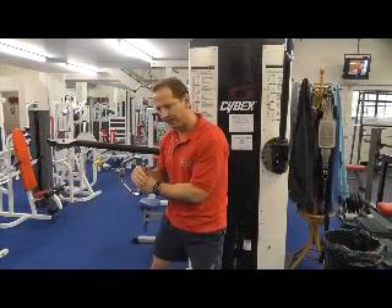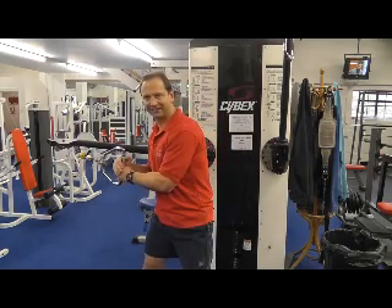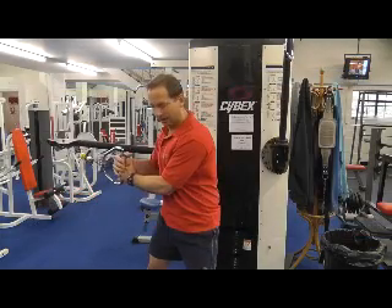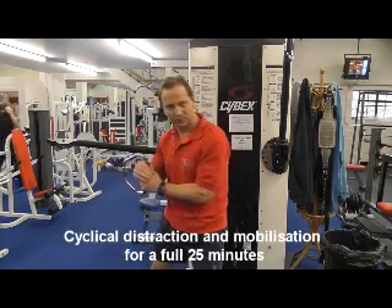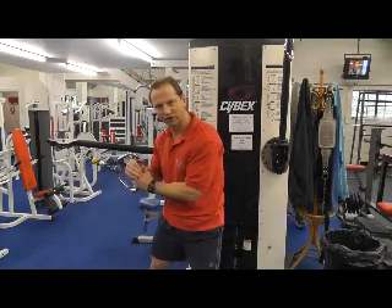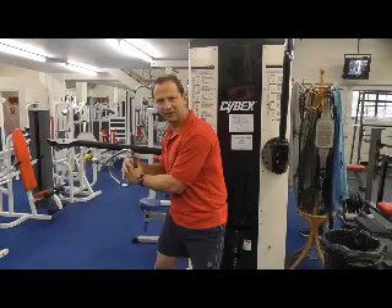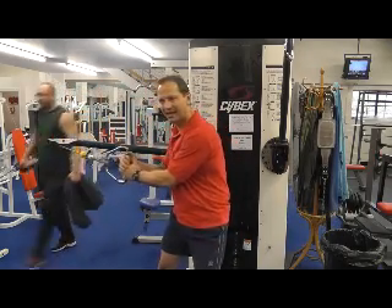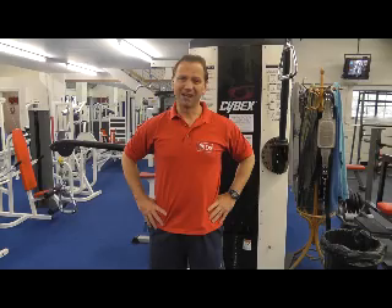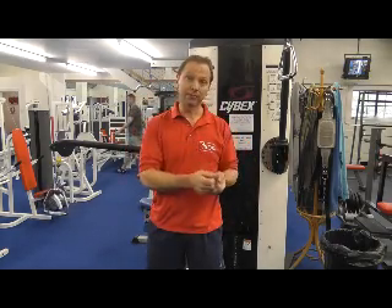I'm applying the mobilisation in the longitudinal plane, then relaxing but not taking the tension off completely. Trying to do this manually means constant tension on the whole body — applying it again for one minute, and that was already hurting after about 20 seconds. Then the very gentle oscillation, then releasing and bringing it on again. Applying that kind of distraction mobilisation manually along the length of the spine while controlling the pelvis is simply impossible. That's where the IDD treatment tool comes in to help clinicians decompress the disc.